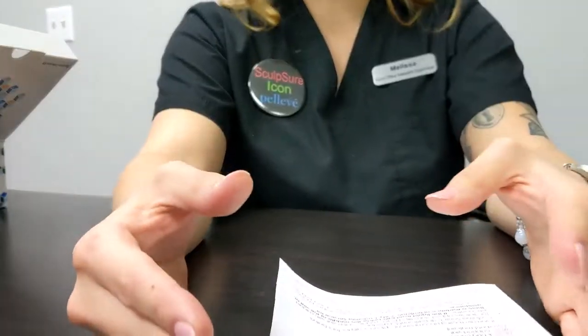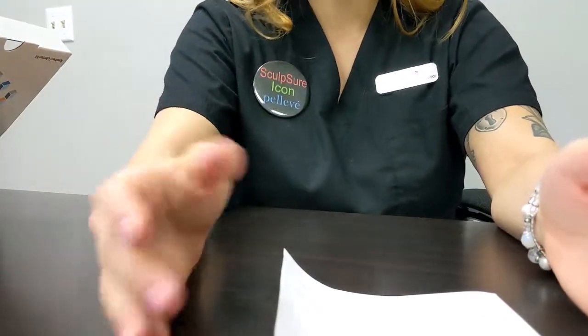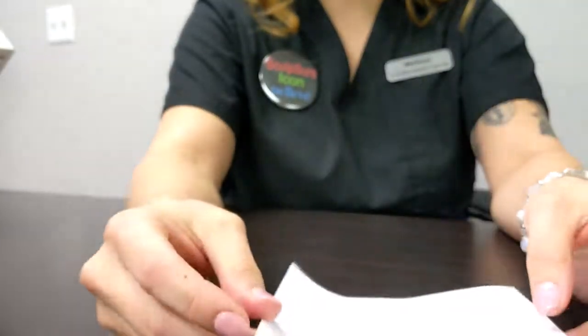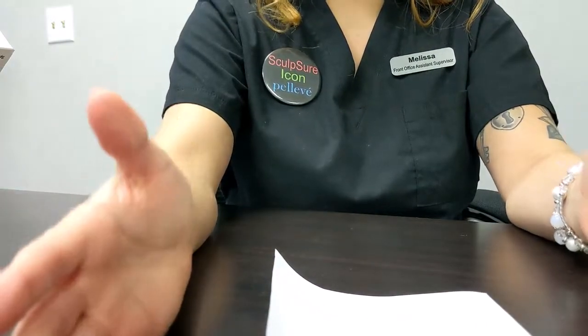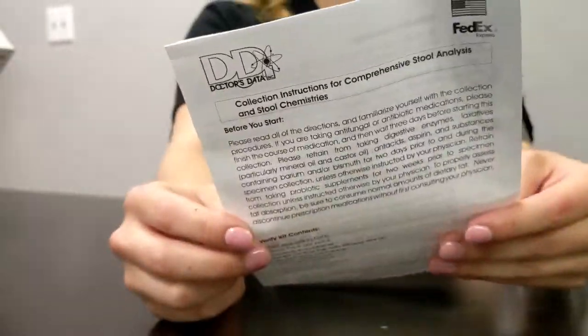If you're one of the patients who was ordered to complete a stool test and start probiotics at your appointment, complete the stool test first and then start your probiotics. Make sure you do that, or else it will show us the probiotics in the test results, and we want to see what's going on, not what you are taking. So once you have made sure you adhere to these little rules here, had any questions answered regarding them, you can go ahead and get started.